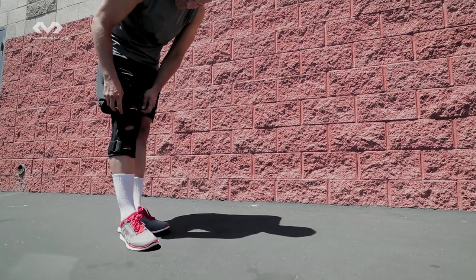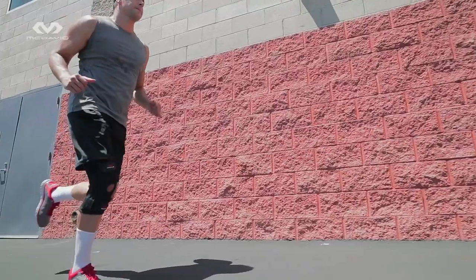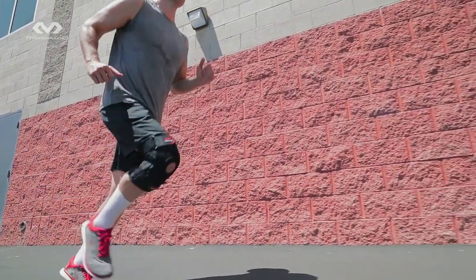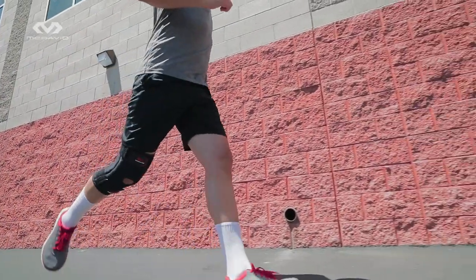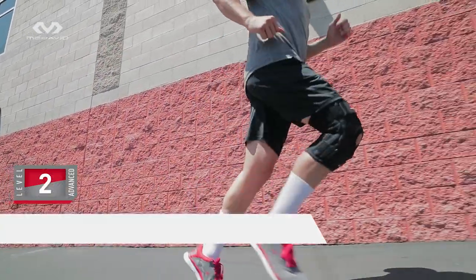During extended use, be sure to recheck position and tension and adjust if needed. The McDavid 425 Knee Support offers protection, moderate support, and pain relief while recovering from injury or dealing with a chronic condition. This is Next Level.